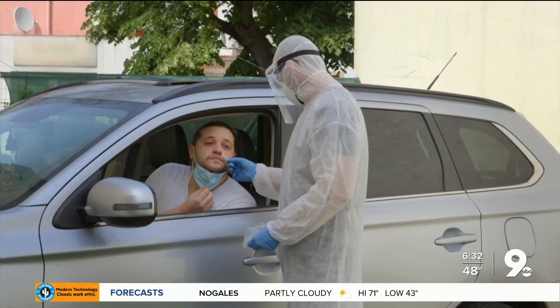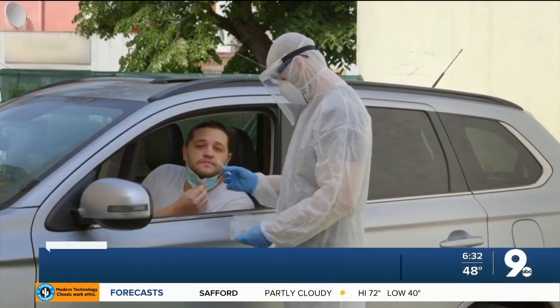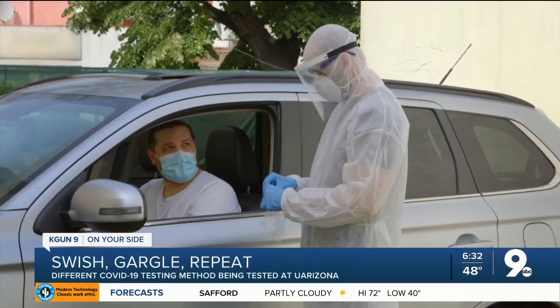The COVID testing experience is one you're likely to remember, but a new testing method used at the University of Arizona is one many would likely prefer. Veronica Acosta explains how the swish-gargle-repeat method is going to work. If you've gotten a COVID-19 test, this nasal swab is one you likely remember well.